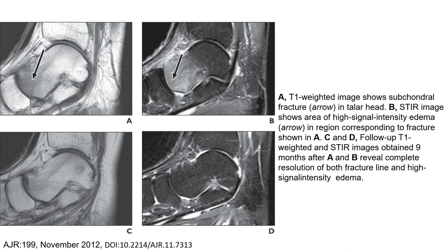In summary, for fractures on MRI, T1-weighted imaging is useful to visualize the fracture line, and STIR imaging is useful to visualize the high signal intensity bone marrow edema.